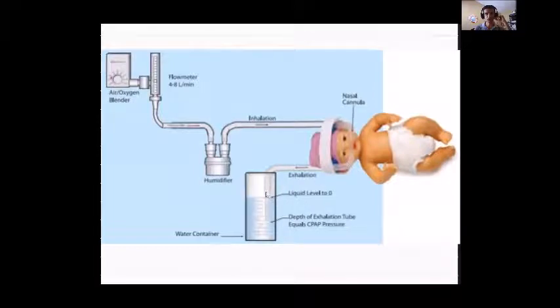So you have this circuit, and then you have a segment that fits in this tube circuit, and this segment is marked with a 1 centimeter scale. And you can see the tube or the bag or the container is also marked, starting from the level of the water, by 1 centimeter each. And then you dip this segment inside the water. So the more you dip, the more centimeters you get. These centimeters will block the flow and will give you how many centimeters the patient is getting.